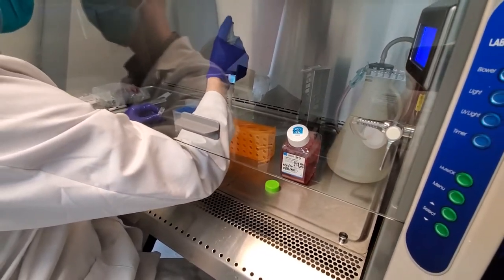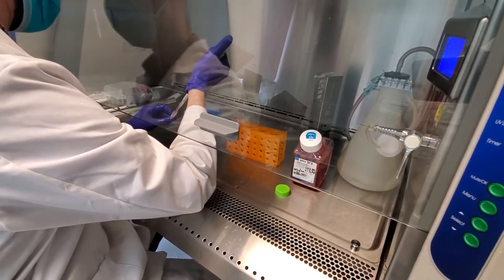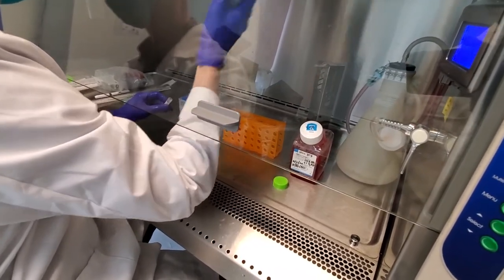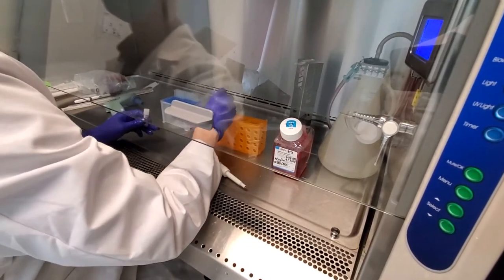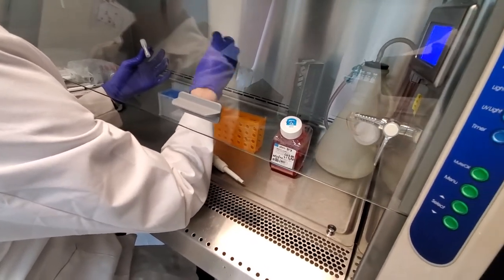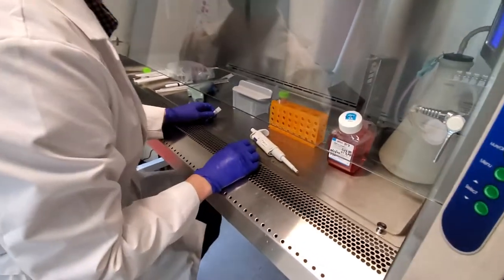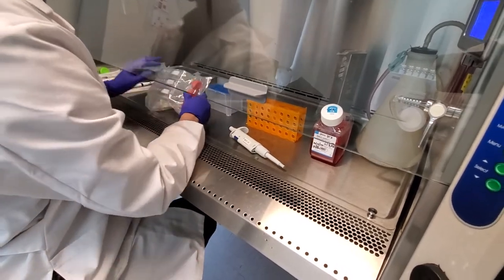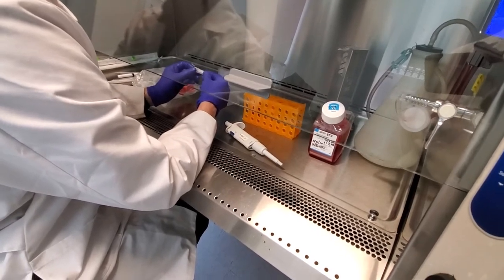I'm going to take some fresh media and add this to cover the cells that might be on the sides. Good. All right, so at this point, I'm just going to give them a little swirl like that. At this point you can spin it down to get rid of everything and then add fresh media if you want to. We're just going to plate these right now. So there should be about a million cells per mil, or a million cells total.